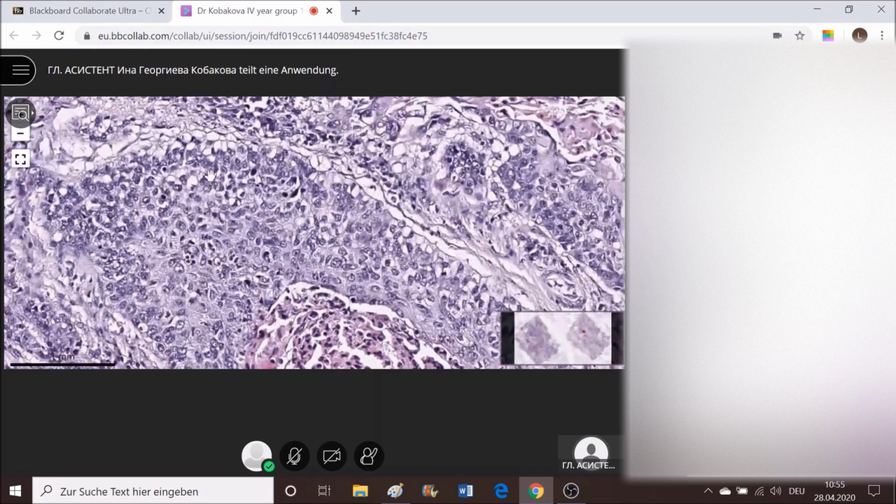Polymorphous cells, hyperchromatic nuclei, dispersed chromatin in certain places. Cytoplasm appears to be more pale, eosinophilic, which means pinkish. Also, the nest is well demarcated, and there are multiple layers of cells which are pretty much resembling the order of squamous epithelium cells. That is how they are getting arranged next to each other on multiple layers.